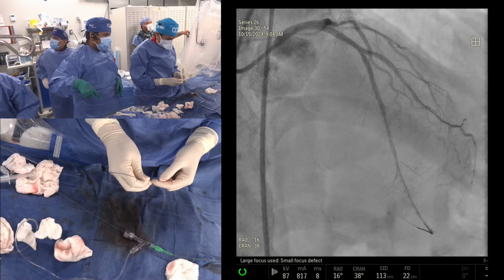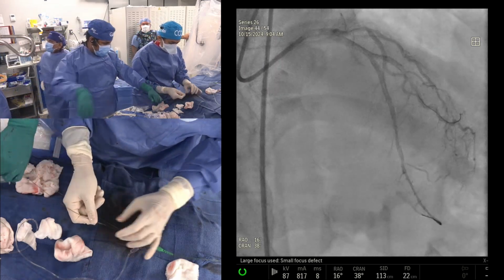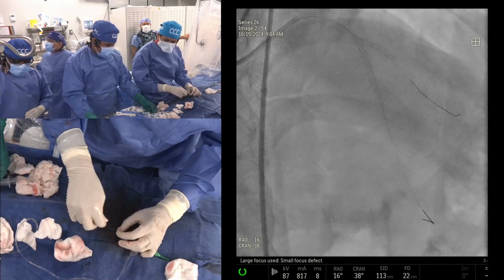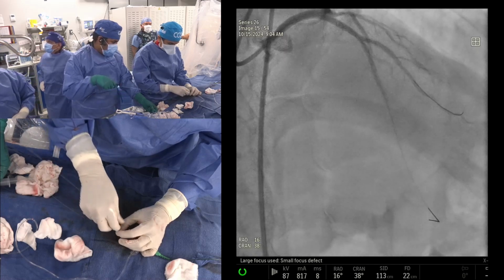Bypass case. No. Or drug-coated, yeah, the drug-coated balloon, drug-eluted. Yeah, which I think is completely distal LAD? Right. Yeah, distal LAD. Yeah. And a few other suggestions that this is more of a nano crush than a mini crush, but all those are good observations.